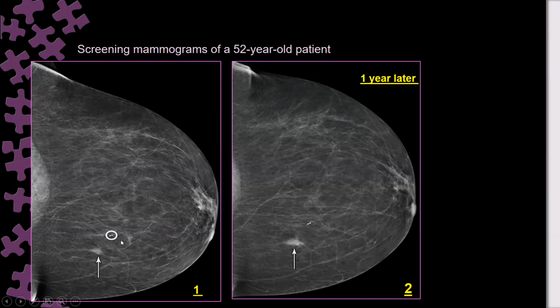It looks like a bilobe or linear or coiled or ribbon, this is a small object. This is a tissue marker. Here they just labeled it with a circle to show it for you. But this one is the same as this one. So there is a breast tissue marker.